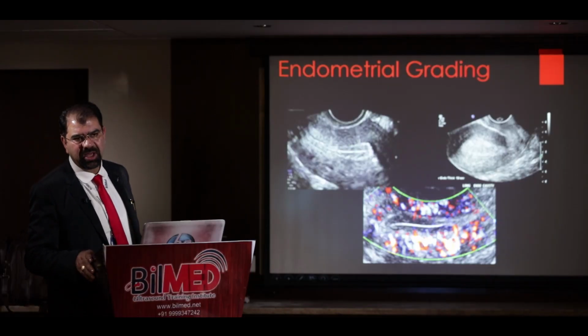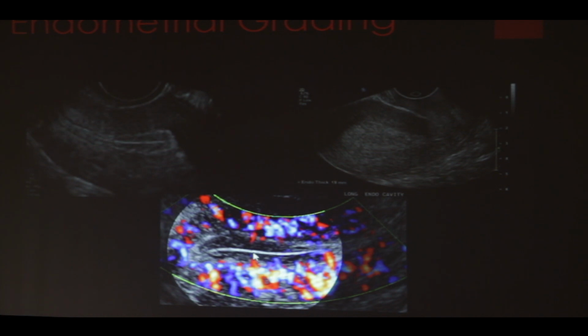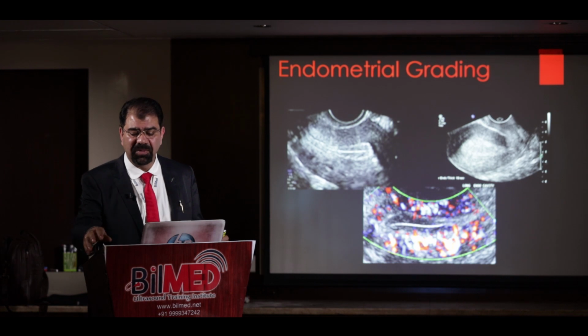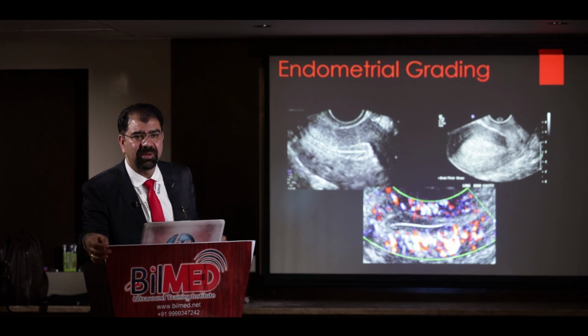Now what is the point here? Why am I putting color? The fertilized ovum is coming and dropping into the endometrial cavity. It has to get implanted. What is implantation? Implantation is nothing but the connection with these vessels. If there is a vessel next to this gestational sac or an implanted blastocyst over here, it will easily make a connection with the vessel if it is very near to it, and if it is very far, it cannot make a connection. It will lead to abortion. And I will not make out whether the patient has aborted, because it will be like a menstrual abortion.